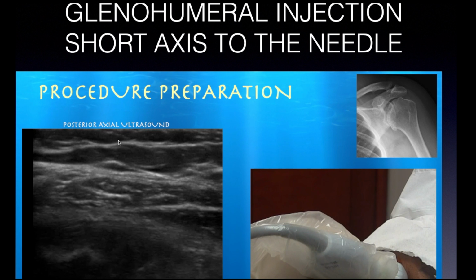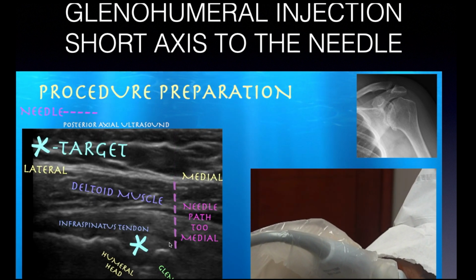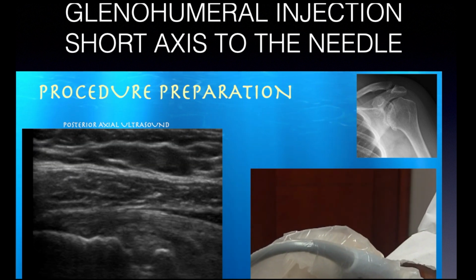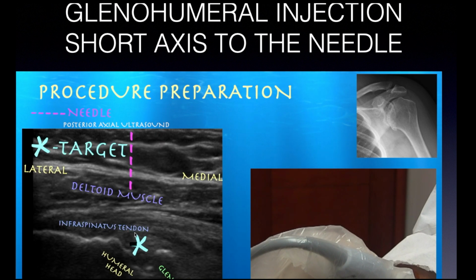So here I'm pushing on the skin, and it looks like I'm going to head a little bit medial to it. So then I continue pushing. Go a little bit lateral. Here it looks like I'm going pretty straight on. So that's where I'm going to go.